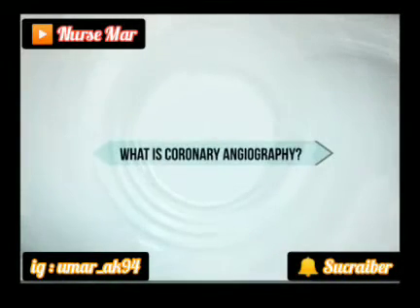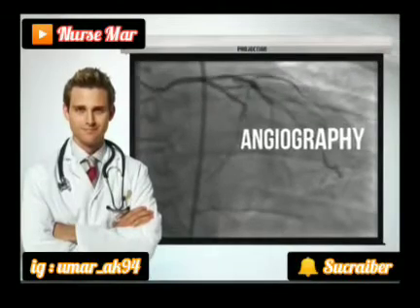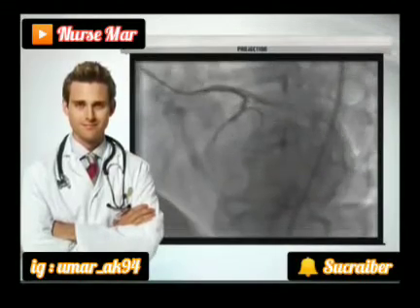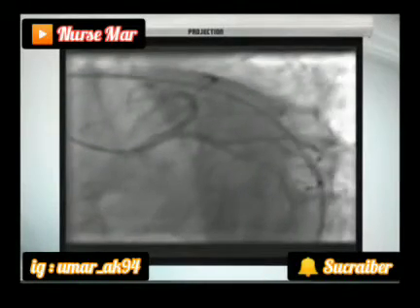What is coronary angiography? An angiography is a reliable procedure to detect the narrowing of blood vessels. It is an X-ray visualization of the heart's blood vessels.